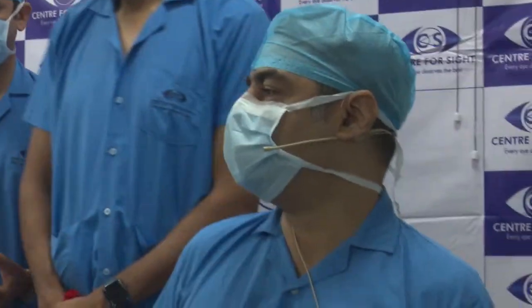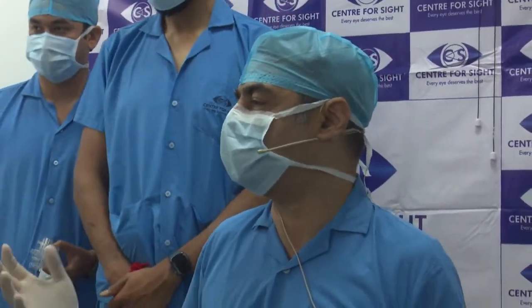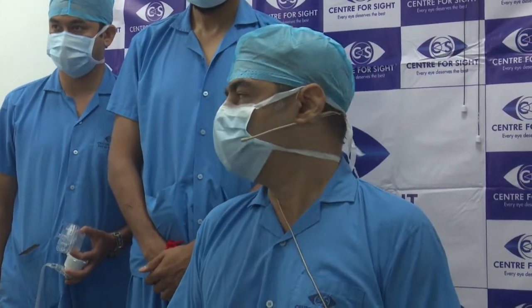So this was the catalyst, a very simple procedure, and I think, as I said, it's the way forward for all cataract surgeons, and at one stage or the other we'll have to move on to this technology. Thank you.